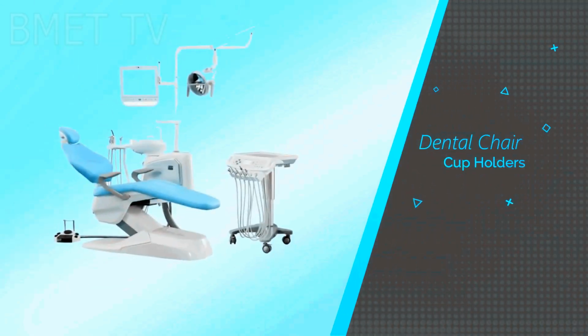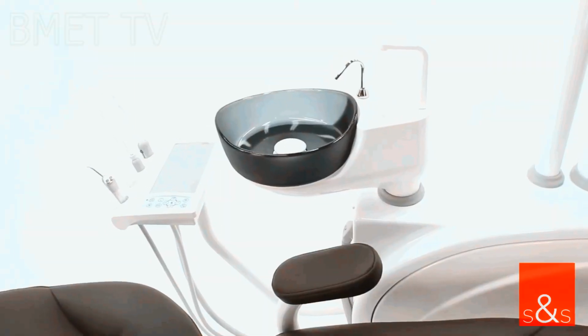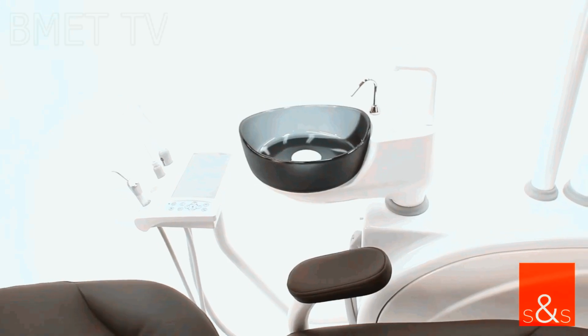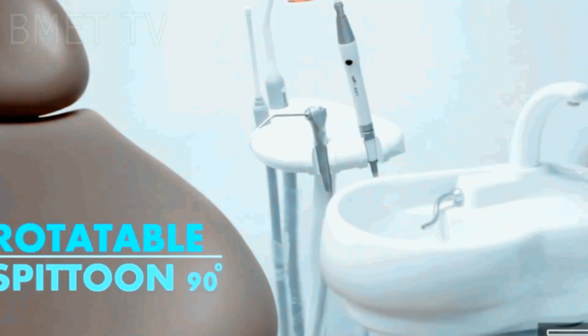The third component is cup holders. Every dental chair has a cup holder. Disposable cups are primarily used for patients to take in water, gargle it, and then spit it out into a spittoon bowl. This is so patients don't feel uncomfortable with blood or debris in their mouth.